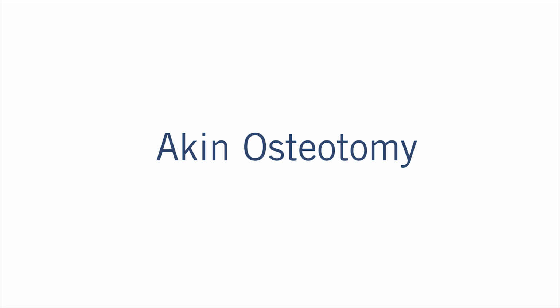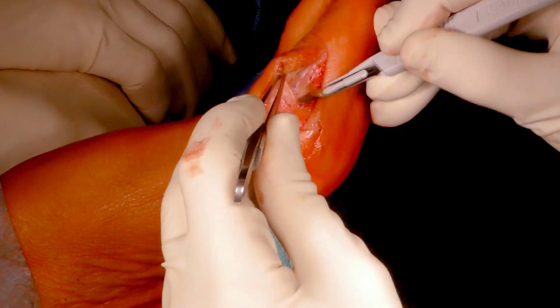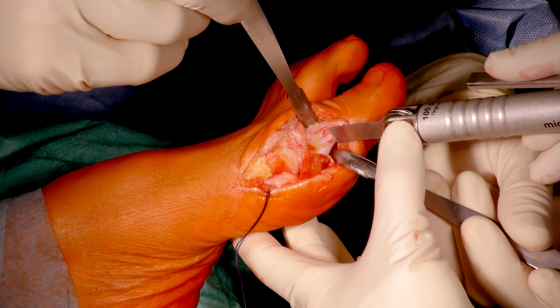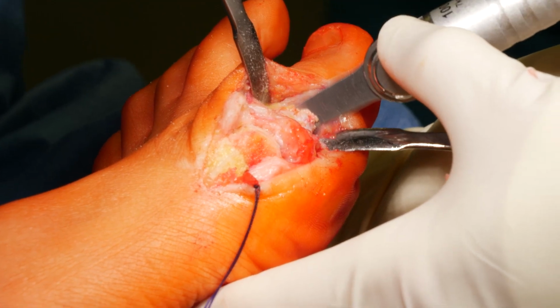Akin Osteotomy. An Akin osteotomy is recommended in most patients. The proximal phalanx is prepared. The soft tissues are protected by Hohmann retractors.